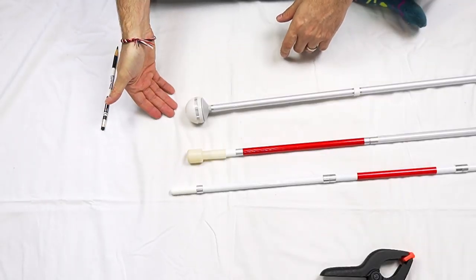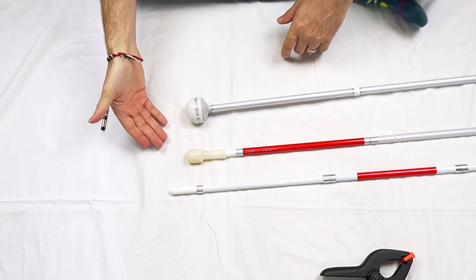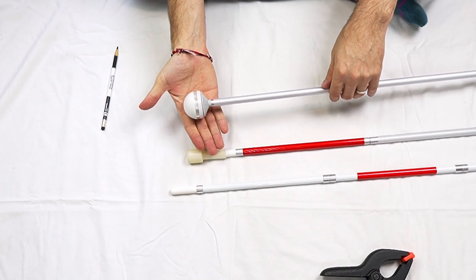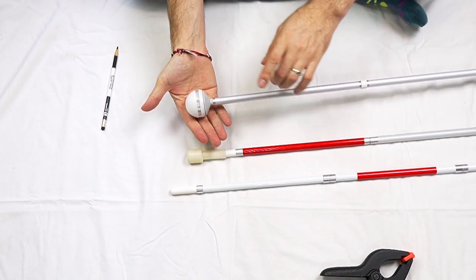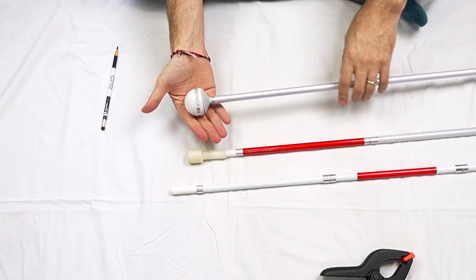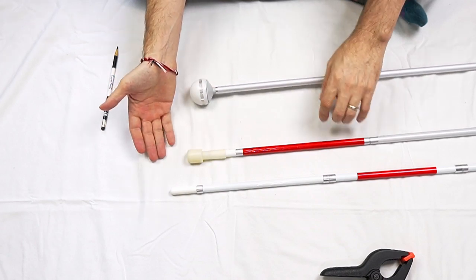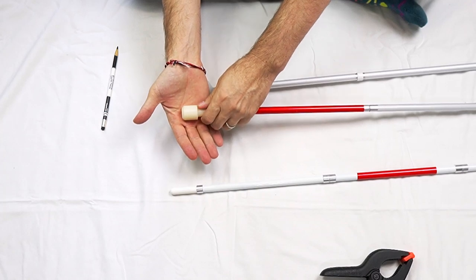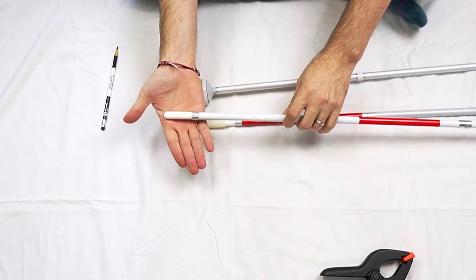Here I have three styles of tips. These are all hook style tips. I have the light up LED rolling tip. If you'd like to learn more about this tip, check out the video in the upper right corner. Next, I have just a small marshmallow style tip. And then third, I have a pencil tip.